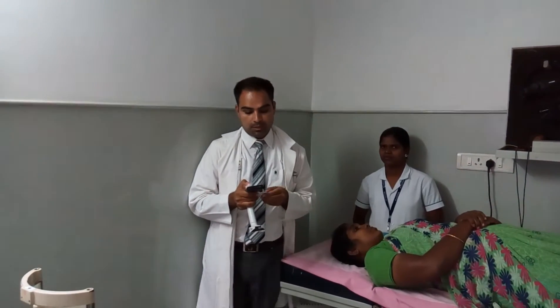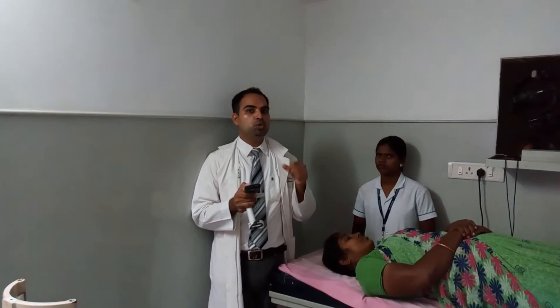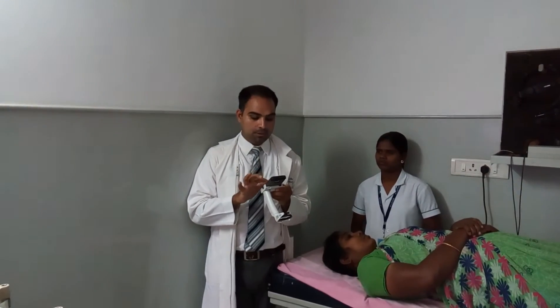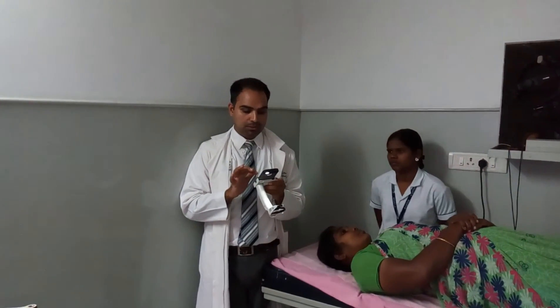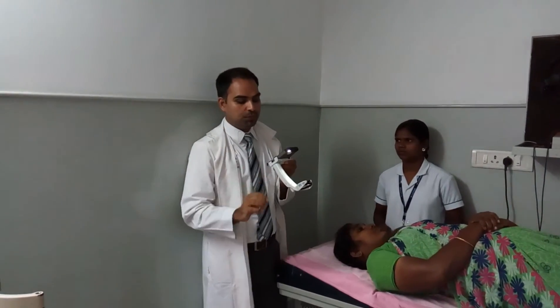In this technique, both hands are involved in imaging, so you require an assistant to open the eyelids. Let me show you how to do it. We start our application and the light comes on.